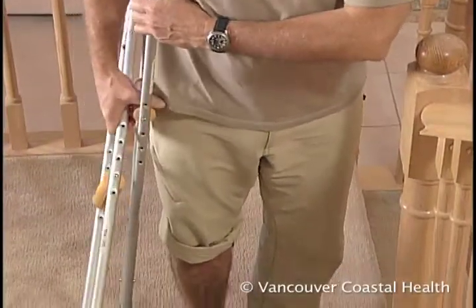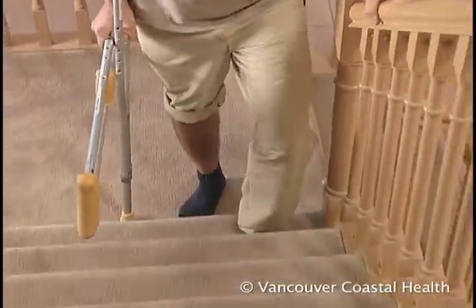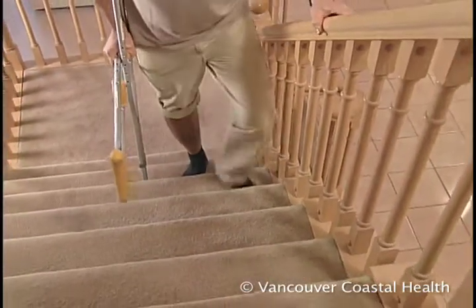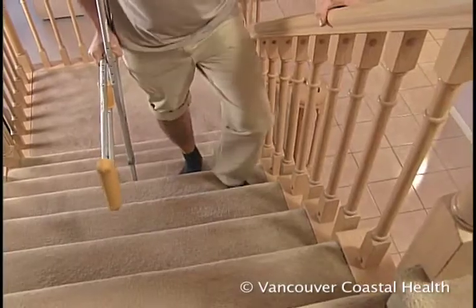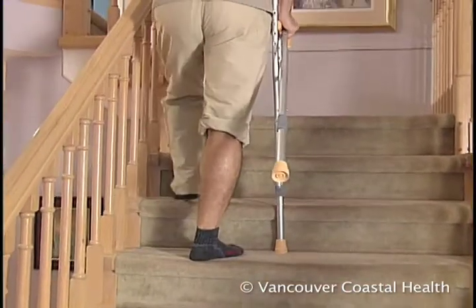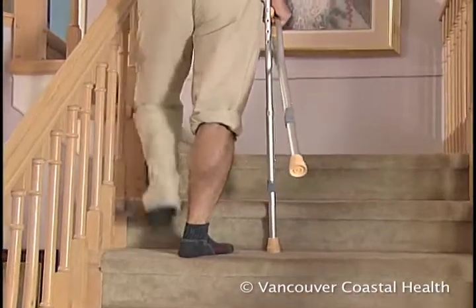When going up the stairs, lead with the good non-surgical leg. Grasp the railing and move your good leg up one step, followed by your crutch and then the surgical leg. Continue this way one step at a time.